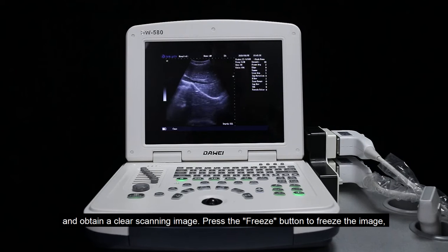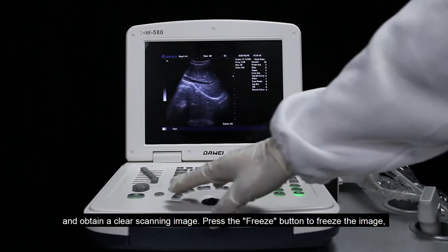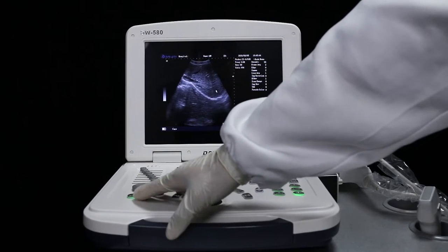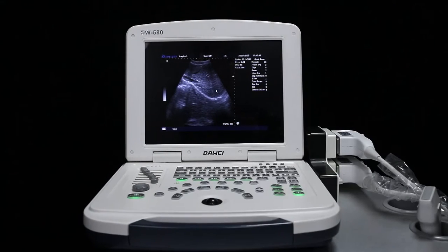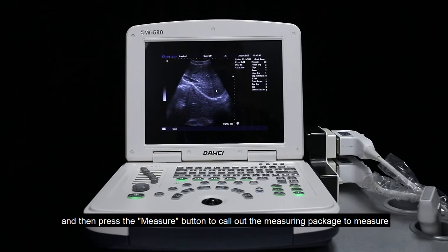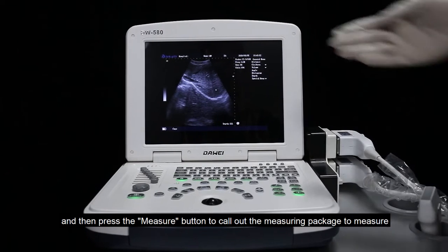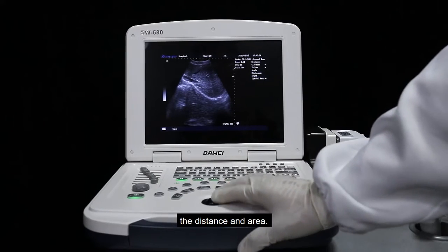Press the freeze button to freeze the image. Then press the measure button to select the measuring package and measure the distance and area.